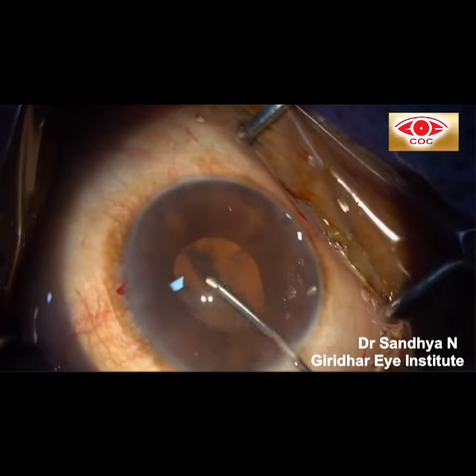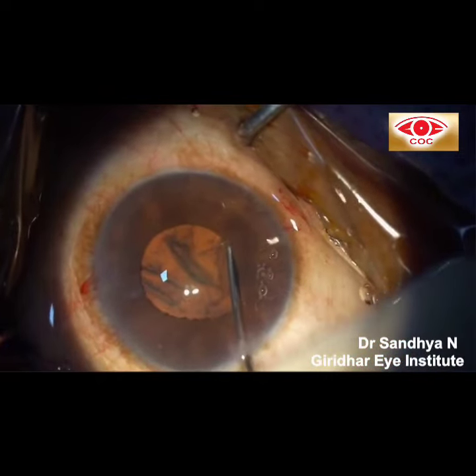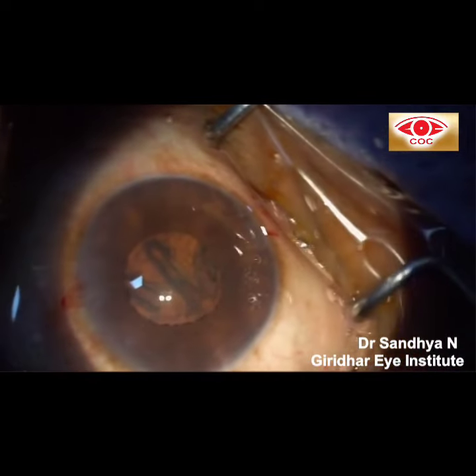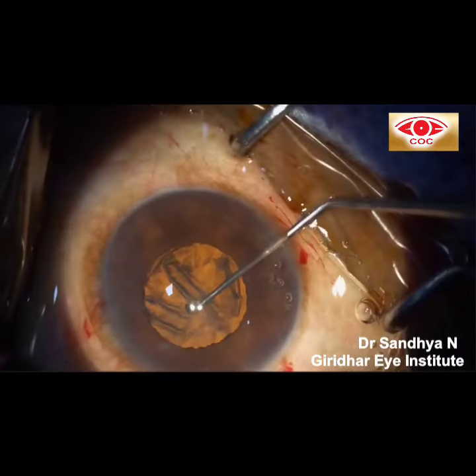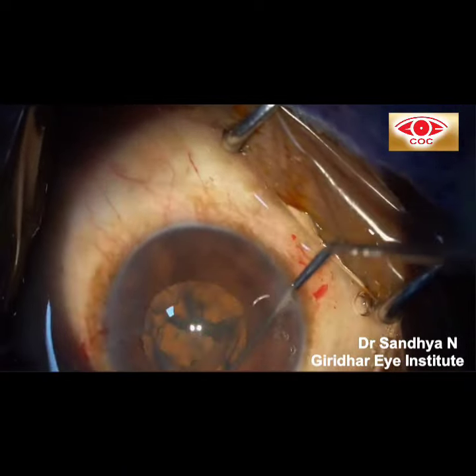You can see the prolapse of iris during hydrodissection. Hydrodissection should be gentle with multiple small fluid waves because it is during hydrodissection that the cascade of IFIS starts. Phacoemulsification was carried out using low parameters, that is low bottle height, vacuum and aspiration flow rate.